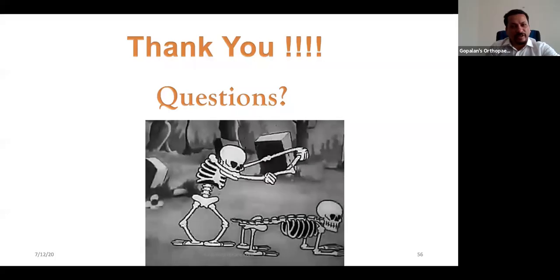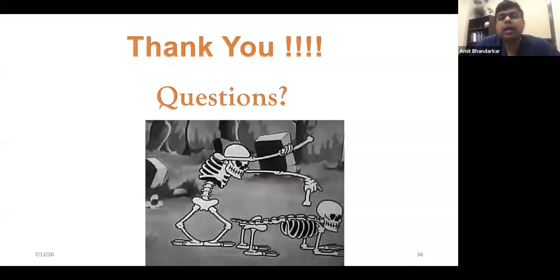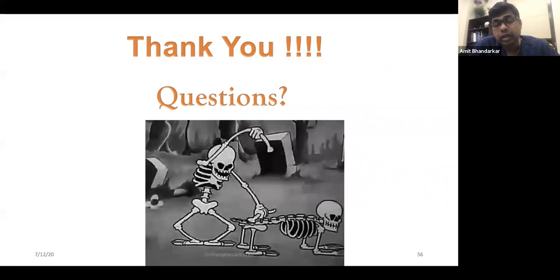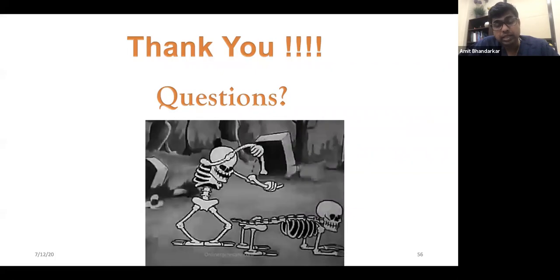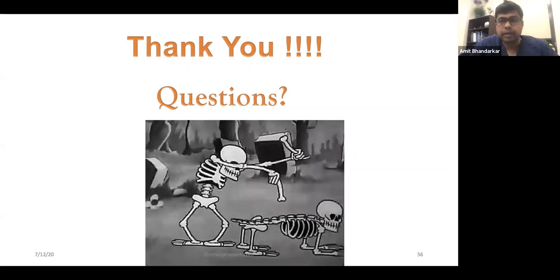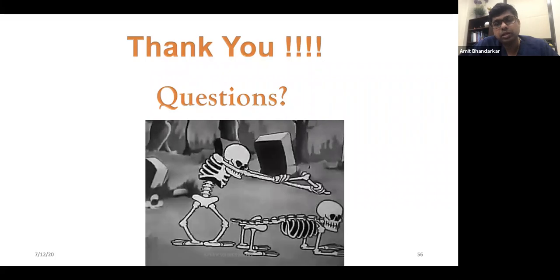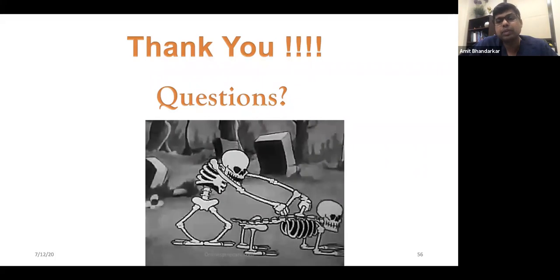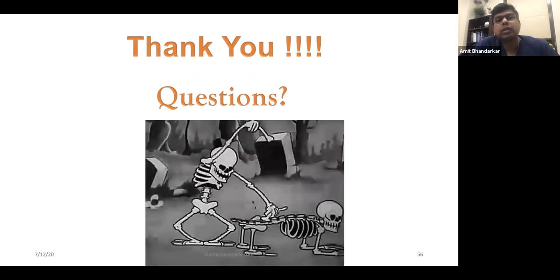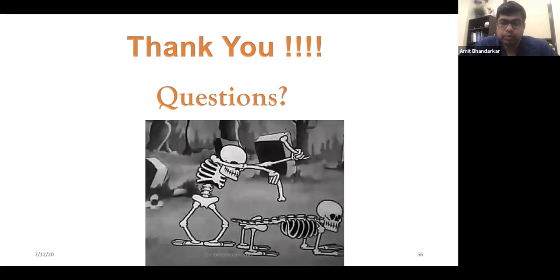And what about 360 degree? What is that exactly? So 360 degree means when I do a TLIF, say I'm doing a MIS TLIF, I also go ahead and do a posterolateral fusion through the same paraspinal approach. Usually it's not as great a fusion as people used to do with open surgeries, where they would expose all the way to the tip of the transverse process and use a burr to decorticate that. Maybe the aggressiveness of bed preparation is not that much in a MIS TLIF, but still, a 360-degree fusion means you do an interbody fusion and also do a posterolateral fusion at the same time. So that's an intertransverse fusion plus interbody, is it? Yes, interbody fusion plus intertransverse fusion.